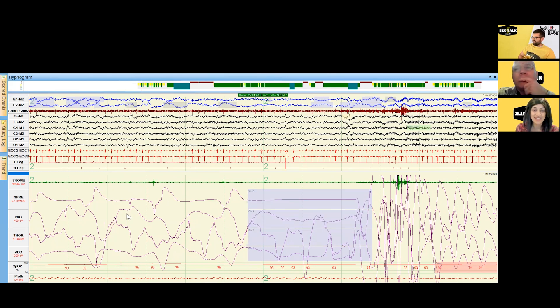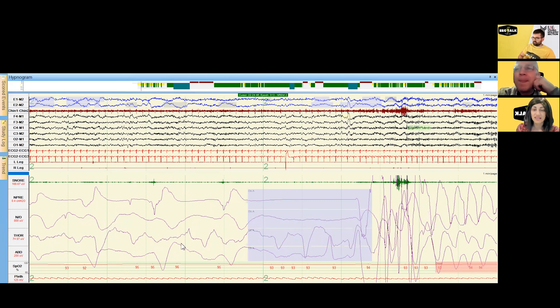Here's an example. Looking at the thermistor, you can see flow is present and then it subsides for this event, but the respiratory effort has persisted — that's why we call it an obstructive apnea rather than a central apnea. This is really a mechanical problem, as opposed to a central problem where the brain stops sending the signal to continue breathing. There are multiple factors contributing to obstructive sleep apnea, particularly the collapsibility of the upper airway.